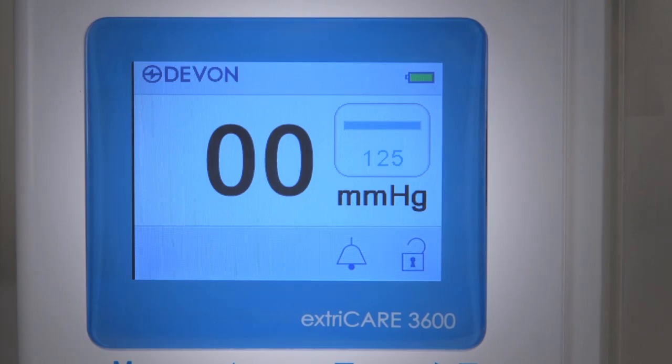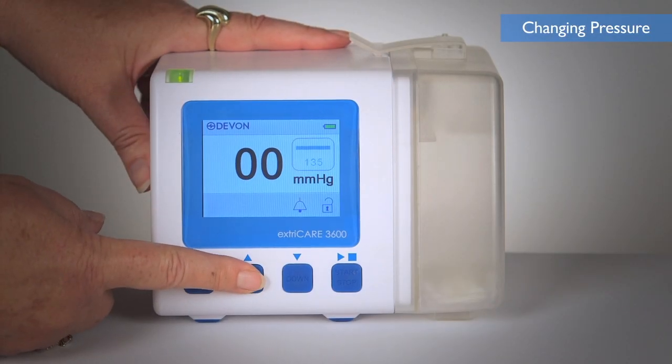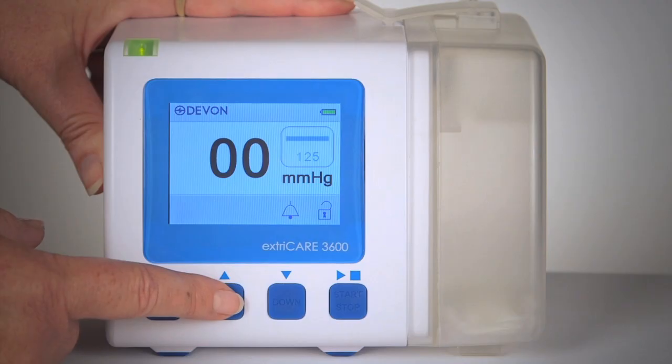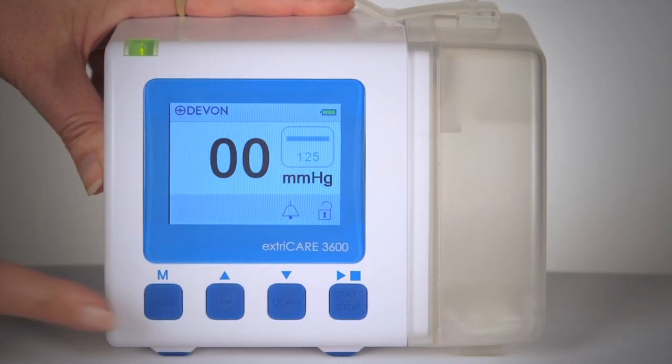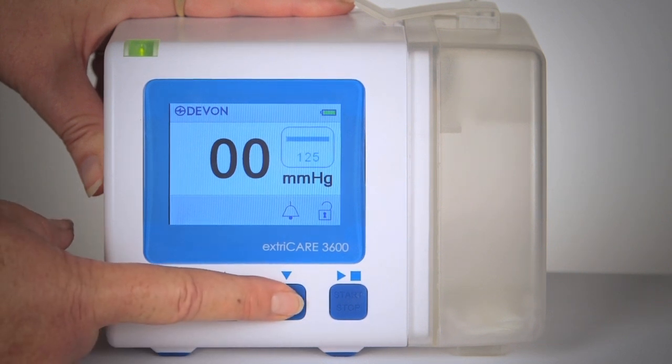The ExtraCare 3600 has a default pressure of 125 millimeters of mercury. To change the pressure, press the up or down buttons. The pressure will change in increments of 5 millimeters of mercury with a range of 40 to 200 millimeters of mercury. By holding down the up or down button, the pressure will change continuously in 5 millimeters of mercury increments.